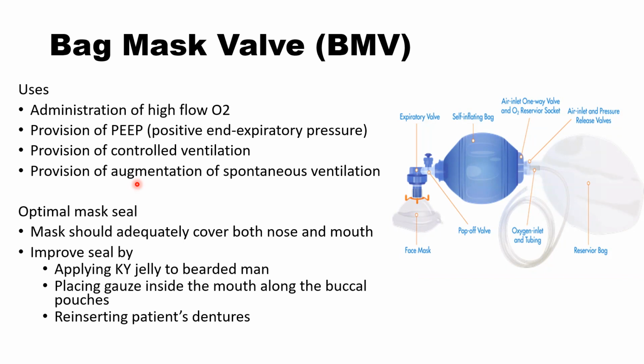In cases where the patient has a beard, you don't take a knife and start shaving him. You can use KY jelly. Use KY jelly on a bearded man.